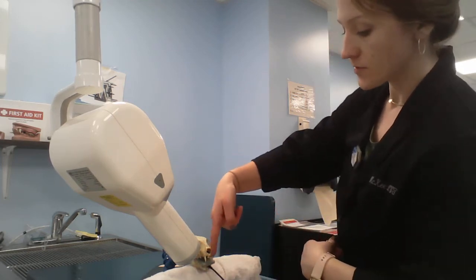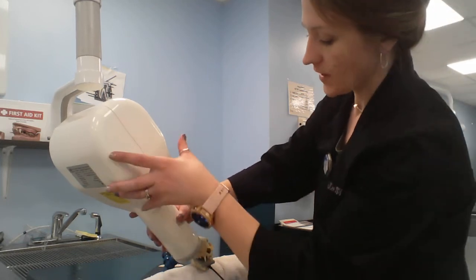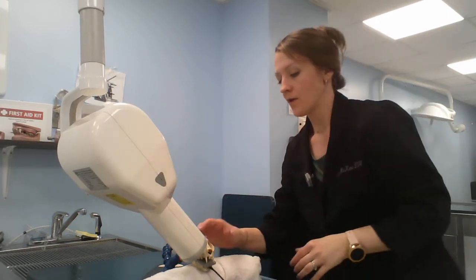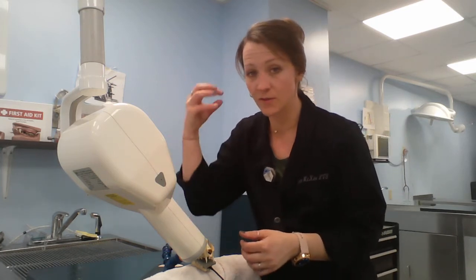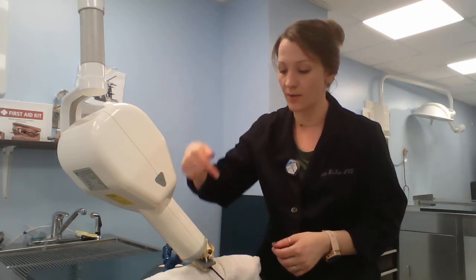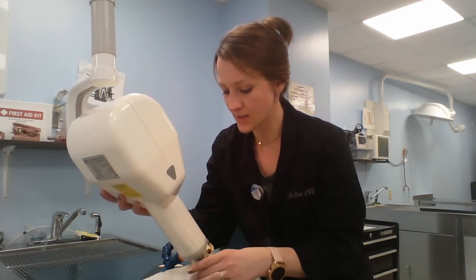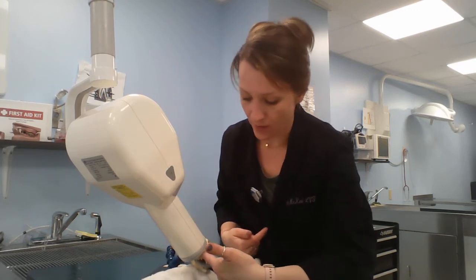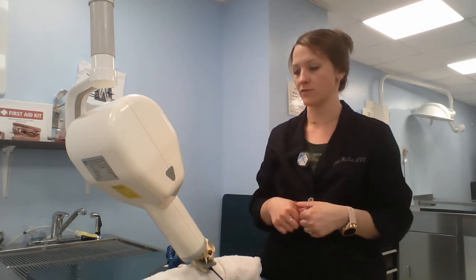Then you're going to find your angle. So you're looking down at your sensor and at your teeth, and finding your angle. Now, cats have a really big zygomatic arch, so it gets in the way. You're basically going to be resting right on it and looking right in their eyeball. Again, make sure your teeth are in the middle of the beam, so you're hitting that at a 45-degree angle.